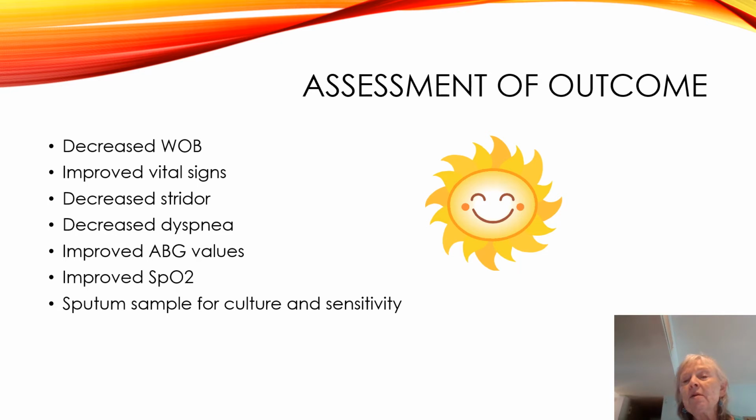So when we're using nebulizers or aerosols for our patients, like I mentioned, you have to do a good patient assessment. Remember, you're going to have to do the vital signs. You want to know what their respiratory rate is. You want to know what their heart rate is. On occasions, you need to know what their blood pressure is. You definitely need to know what their breath sounds are. Are they wheezing? Are they having bronchoconstriction? Do they have stridor? So all the things that you learned in patient assessment, this is what you're going to put to use at this particular point.